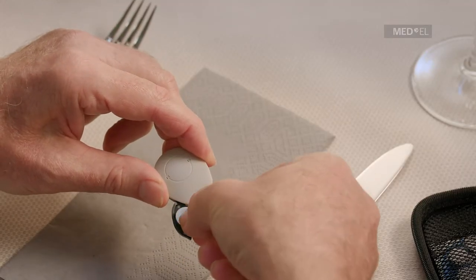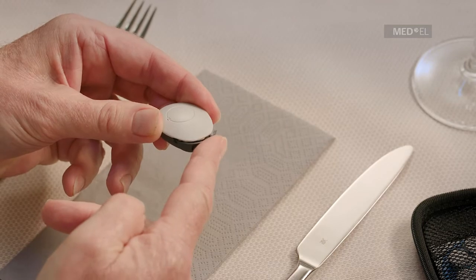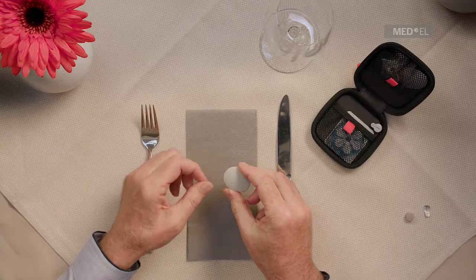Place the new battery in the compartment with the positive pole facing upwards. Push the battery compartment door until it clicks into place.